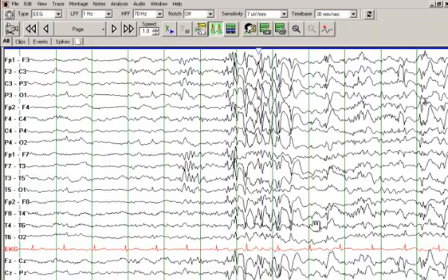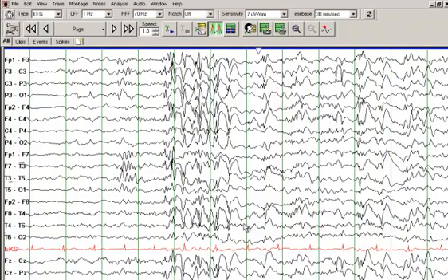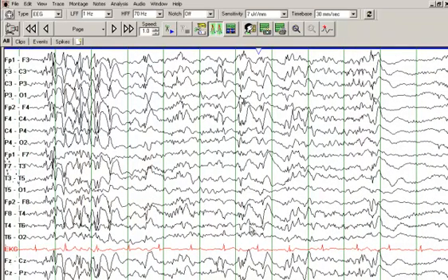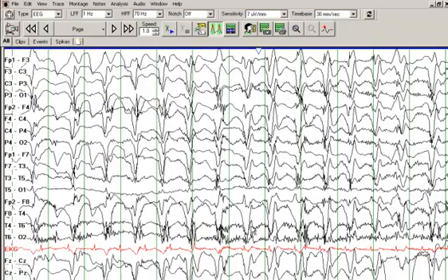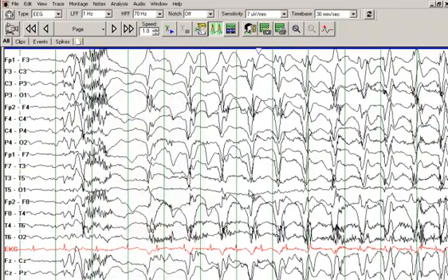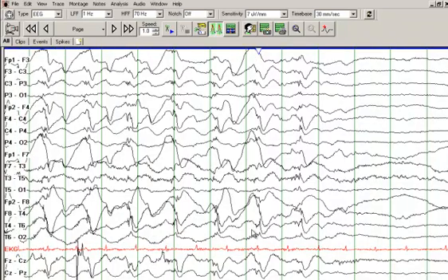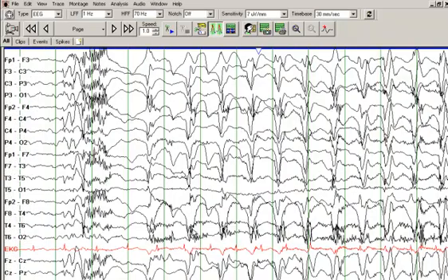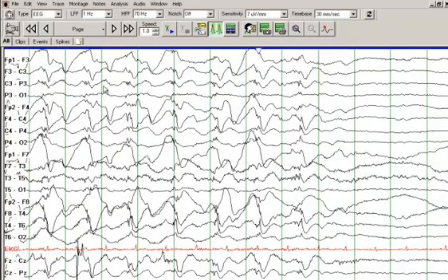This is the seizure that was recorded, although it does not look a whole lot different from the interictal discharge. The patient was asleep and had a brief tonic episode lasting 2 to 3 seconds, with no further motor activity, and slow activity followed after that. This is another seizure that started with motor activity — a 1 to 2 second brief tonic activity involving both upper arms, followed by brief clonic jerks lasting almost 25 to 30 seconds. Although it starts with fast activity, it tends to slow down as the seizure progresses.